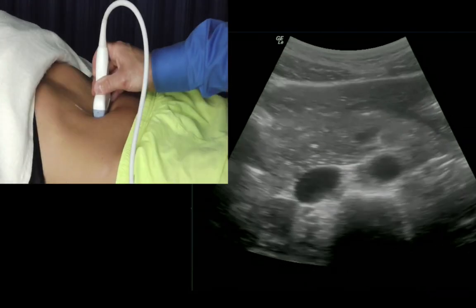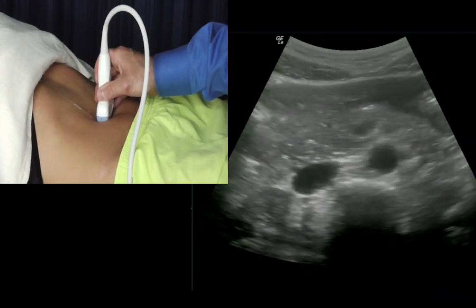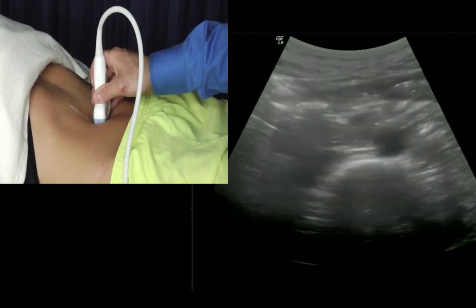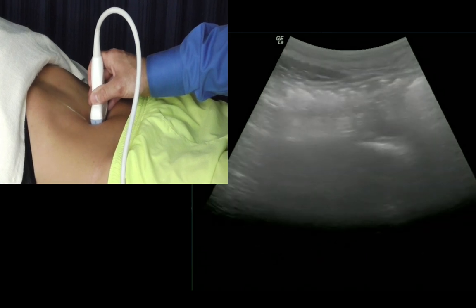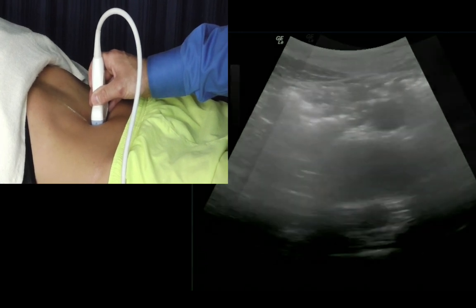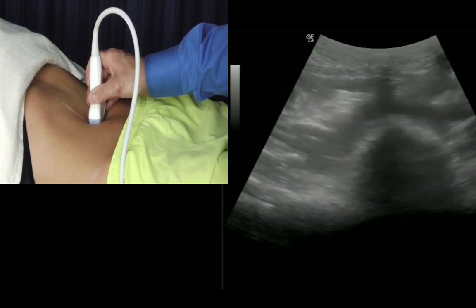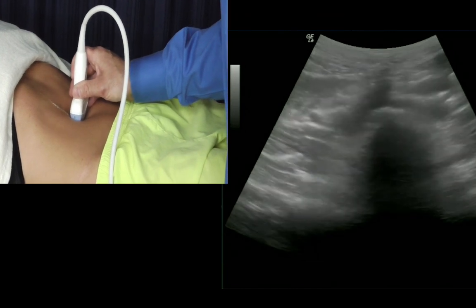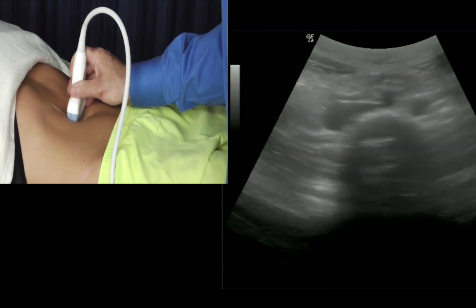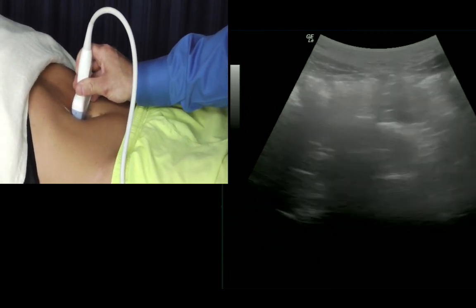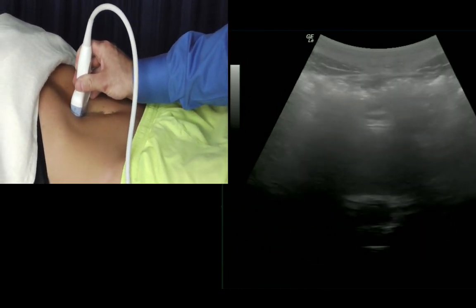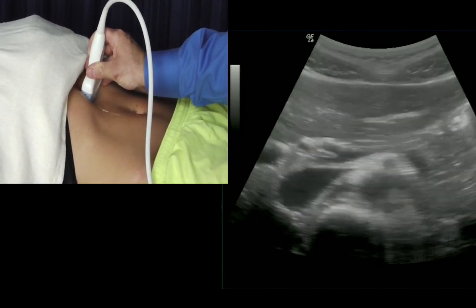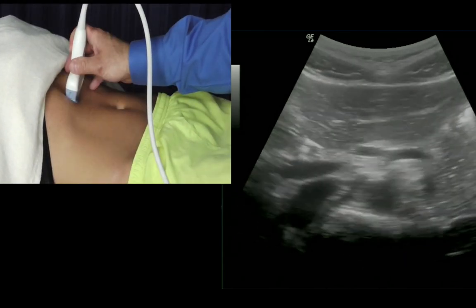As we slide down the abdomen, the aorta becomes more superficial due to the lordotic curve of the spine. Abdominal gas often obscures the aorta. However, with slow, gentle pressure, the gas will move to the side and the aorta will become visible again. It can be difficult to identify all the branches of the aorta, particularly in large patients.